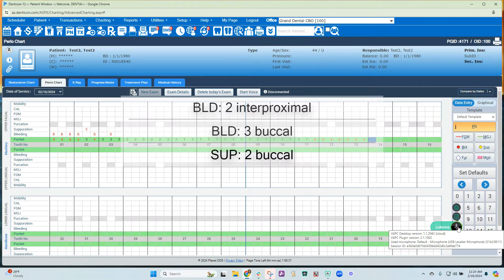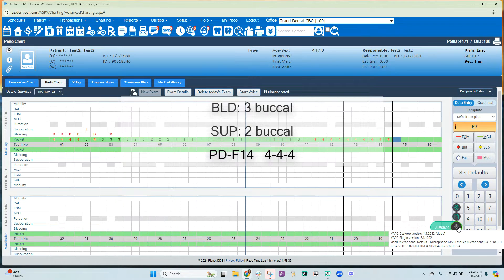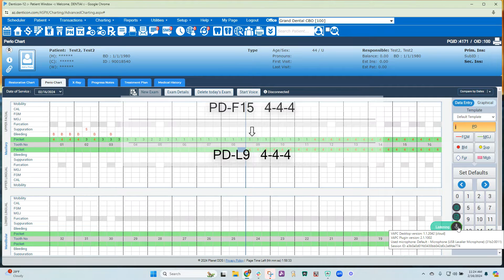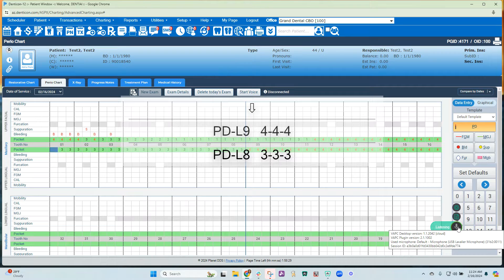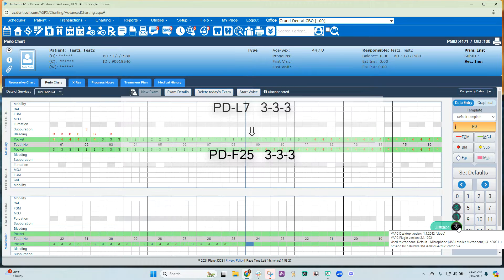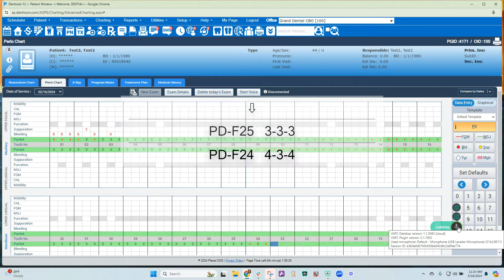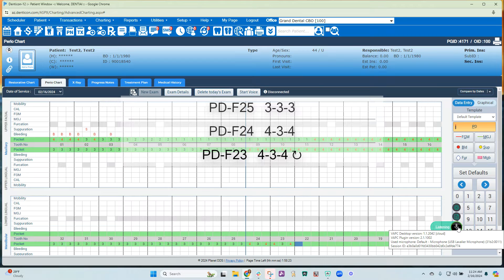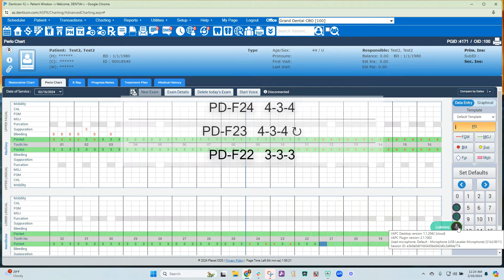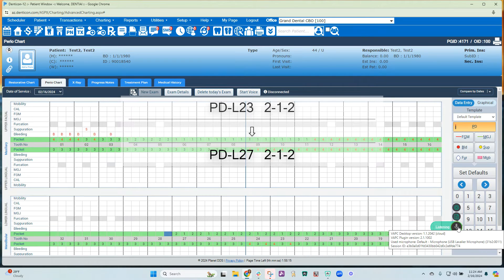4 4 4 repeat 10. 3 3 3 repeat 15. 4 3 4 repeat. 3 3 3 repeat 10. 2 1 2 repeat 5. 3 3 3 repeat 4. 4 4 repeat 10. Jump Gingival Margin.